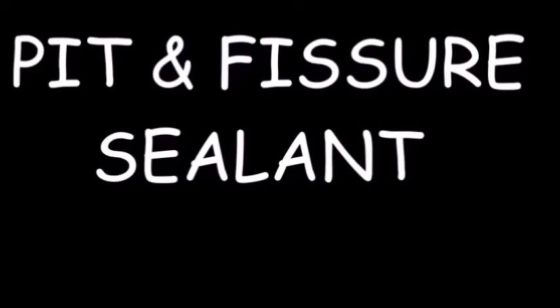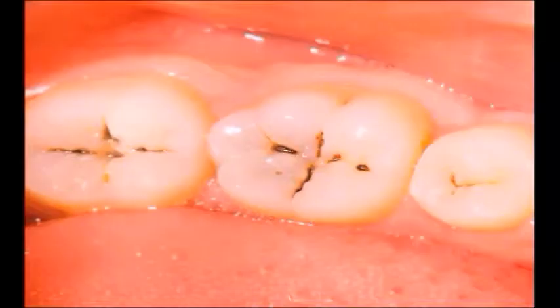This is the video of pit and fissure sealant. Pit and fissure sealant is a type of preventive restorative measure for the initial carious lesions present in the primary and permanent teeth. Deep pits and fissures are the indication for the application of the sealant. We will present the steps involved in the clinical application of pit and fissure sealant.